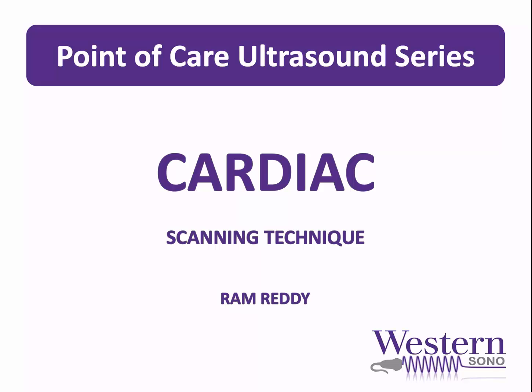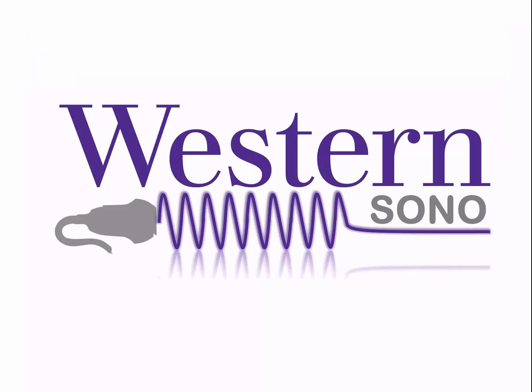We would like to welcome you to this installment of our Practical Point of Care Ultrasound series, with the focus of this module being the bedside cardiac ultrasound, limited to detection of pericardial effusion and cardiac standstill. As in previous modules, we will concentrate on the practical aspects of generating a good cardiac study, with many more screencasts on various topics being available from our selection at WesternSono.ca.